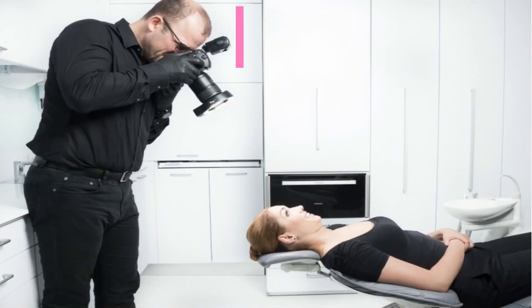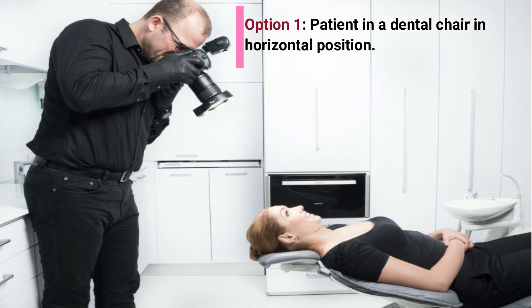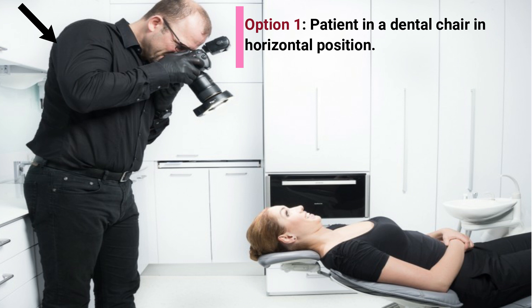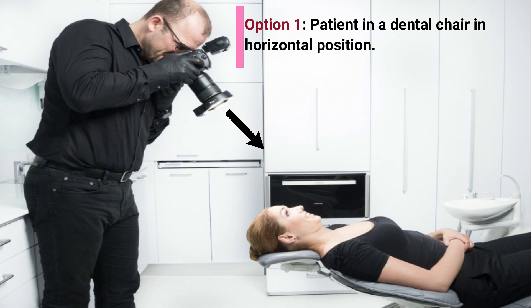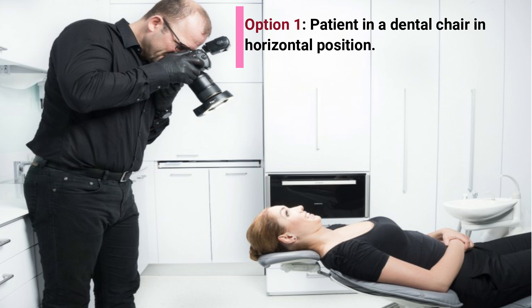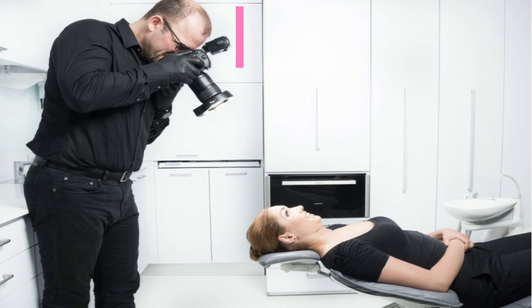The 12 o'clock photo can be taken with two options. Option 1: patient in a dental chair in a horizontal position. Take your position behind the head of the patient and point your camera toward the patient's head. Ask the patient to smile and set the focus point on the front teeth before taking the shot, then ask the patient to look back into the lens of the camera without moving the head.